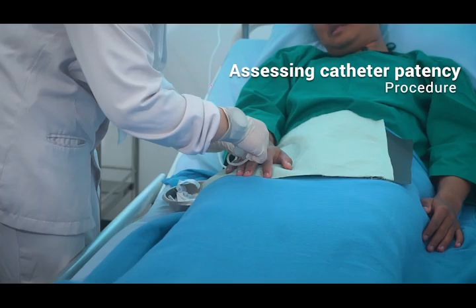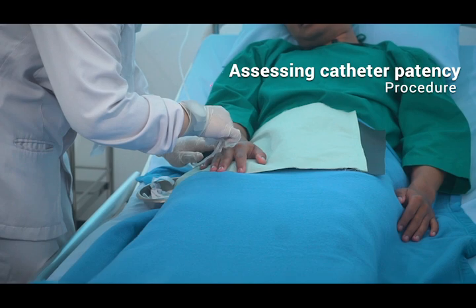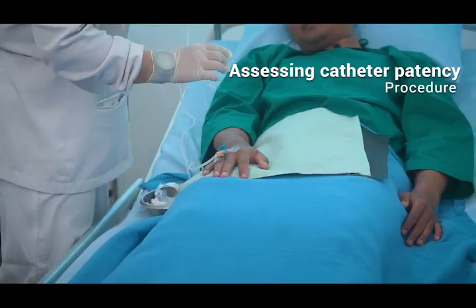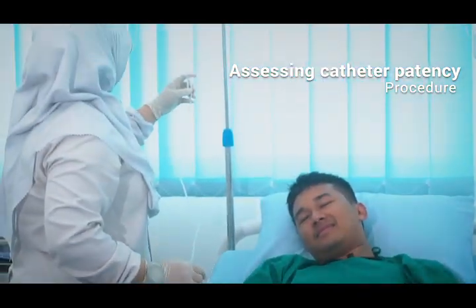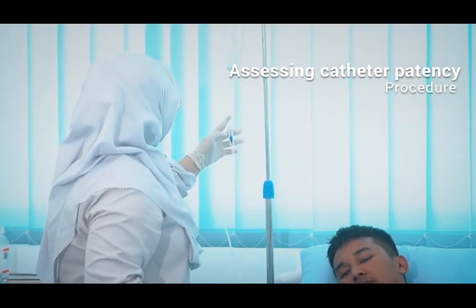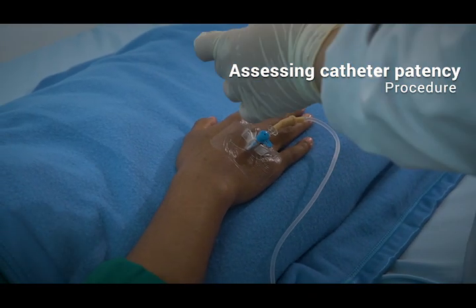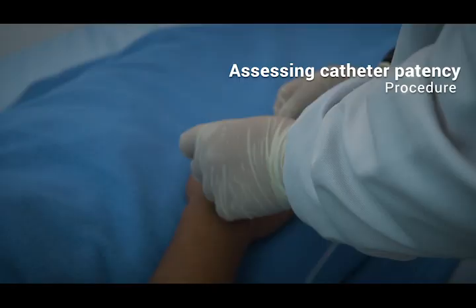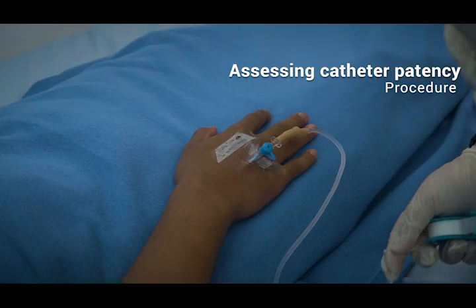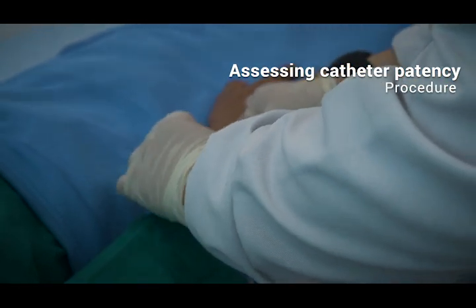Assessing catheter patency. Unclamp the catheter and begin the infusion as prescribed. Monitor the insertion site for swelling. Remove the catheter if swelling occurs or the patient complains of discomfort or pain. Label the dressing with the current date and due date to be changed. Use a joint stabilization device, such as a padded arm board or splint.